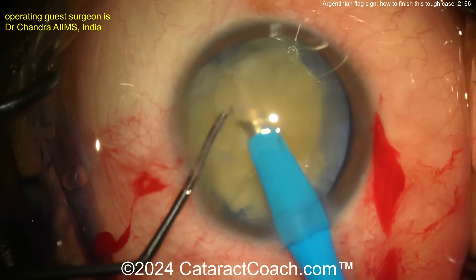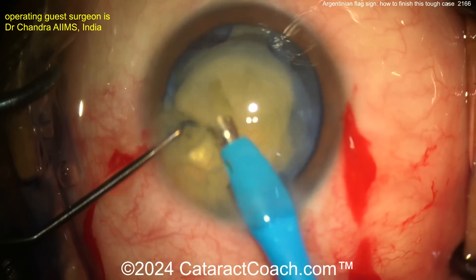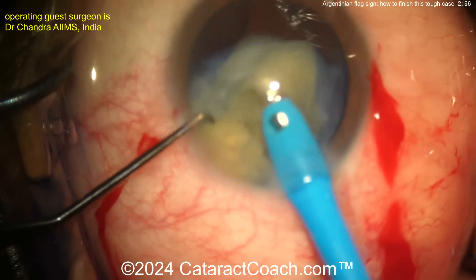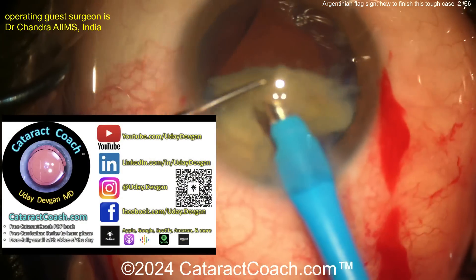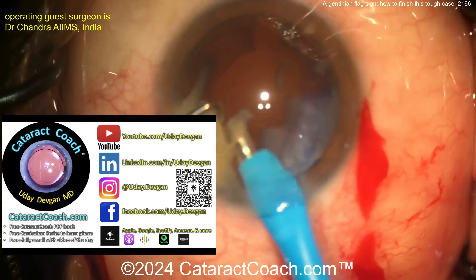I like the idea of bringing the pieces up and out of the bag. I don't want to work in the bag in this case. The bag's got these two huge areas of weakness and it can just go south. Check out CataractCoach.com, the teaching website, and that podcast every single week.